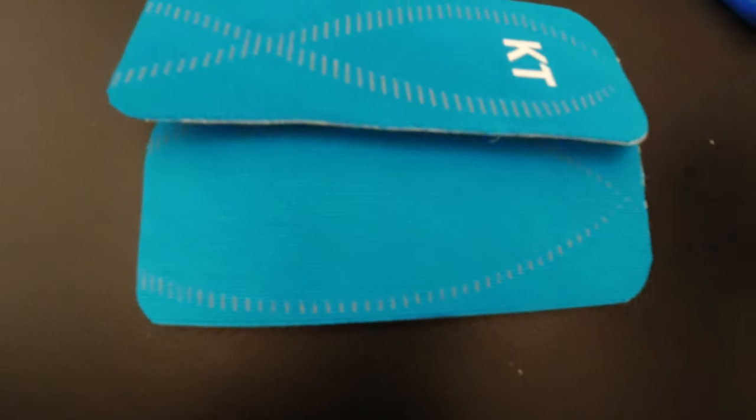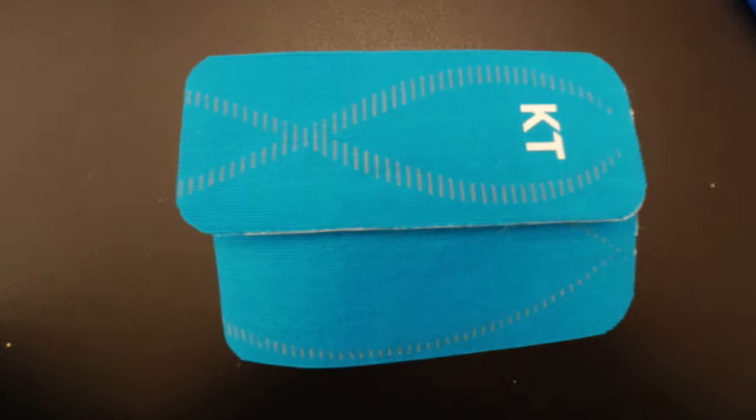After those two pieces of tape overlap, you want to be able to rub them and smush them around as much as possible. I've tried all the glues, I've tried all the clear tapes, I've tried everything — and KT tape hands down is the best.